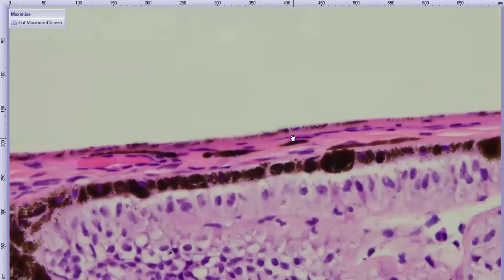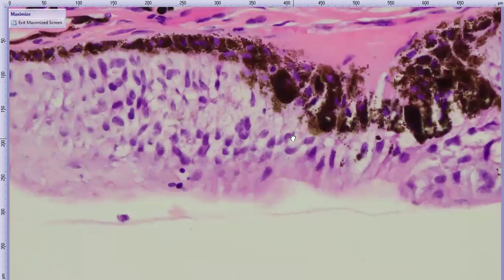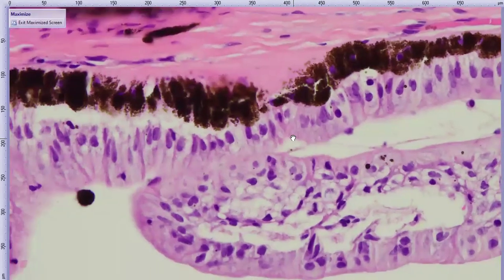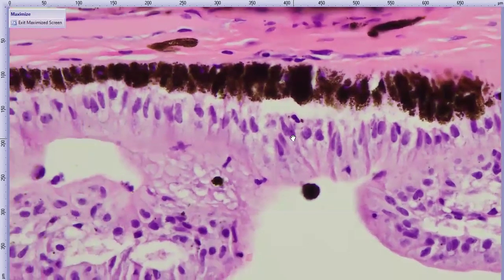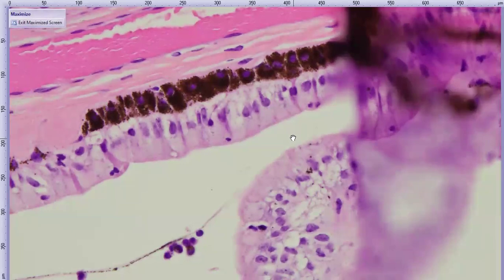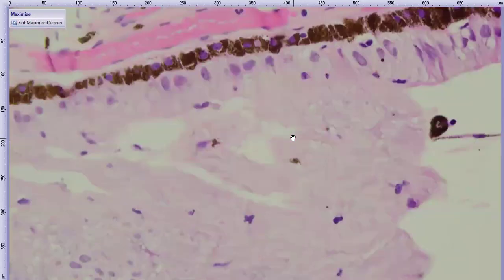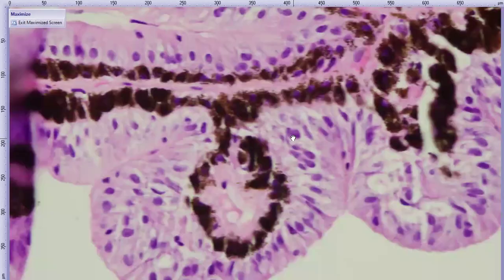The funny thing is, everybody in the world knows them as Cooley bodies, but they were named after someone that was visiting the lab that was working with ERU in horses, and was Dr. Penny Cooley. So it was a nickname that caught on, and I've seen people present it in national meetings. And here you can see the Cooley bodies, so don't try to Google that. So linear intracytoplasmic inclusions are characteristic of, as far as we know, equine recurrent uveitis.